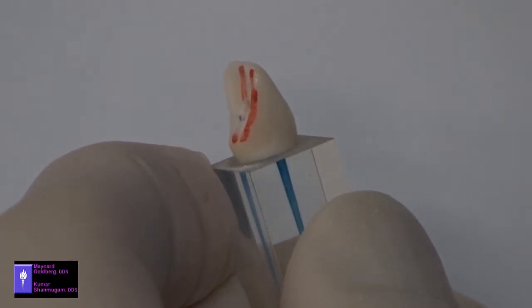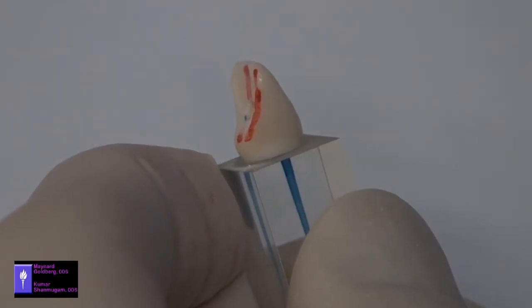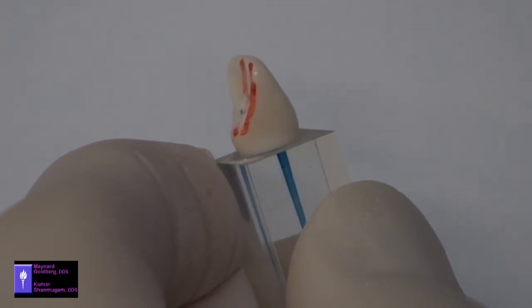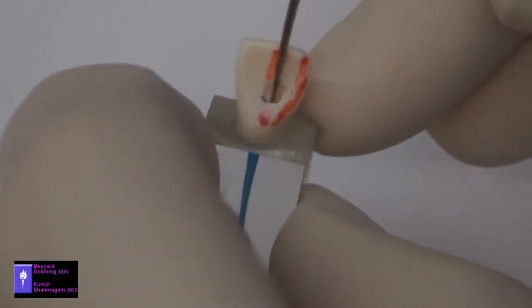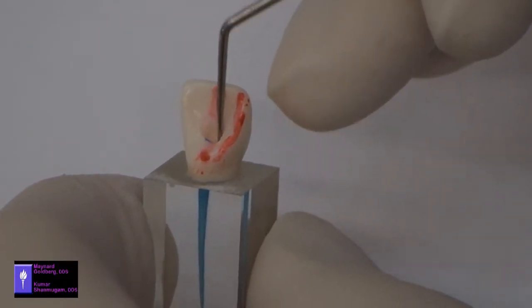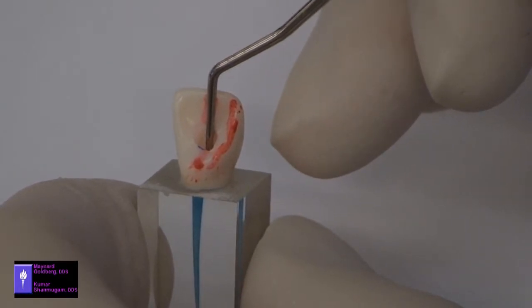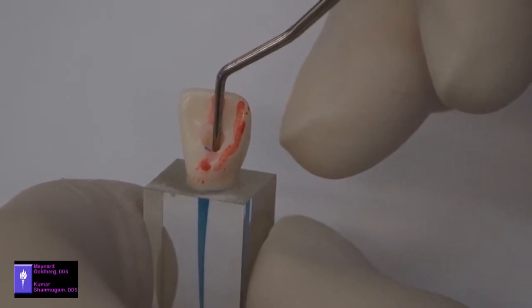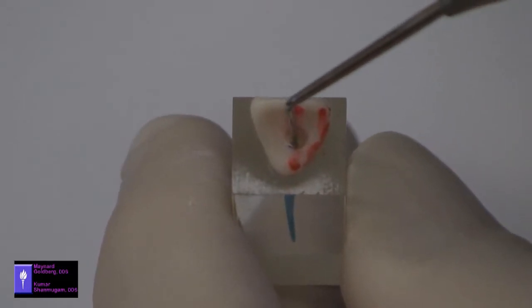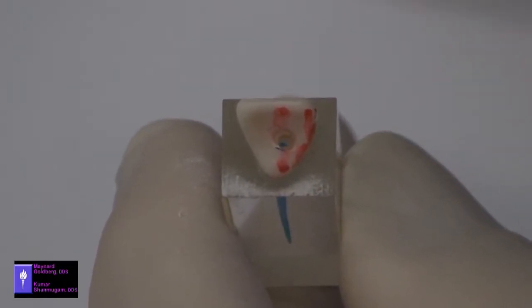I believe I have gone into the roof of the chamber. So I'm going to check with an explorer. And lo and behold, the endo explorer falls into the little penetration hole in the roof of the chamber. Now that we penetrated through the roof, we go to the next step, which is funneling.